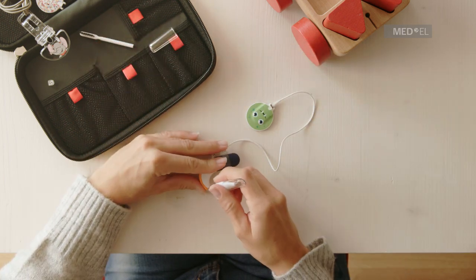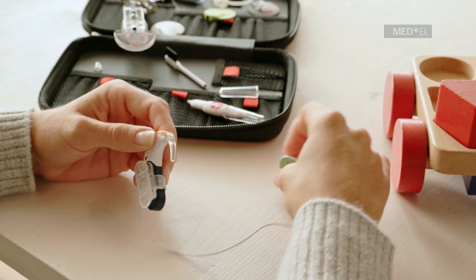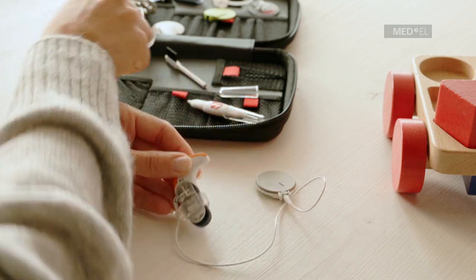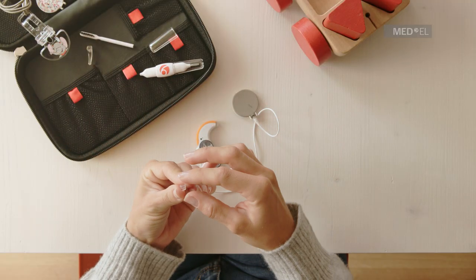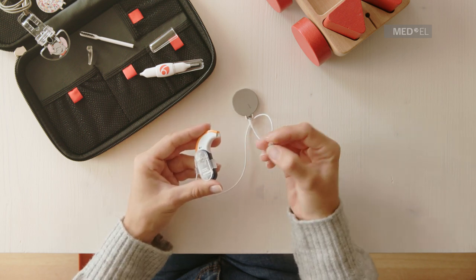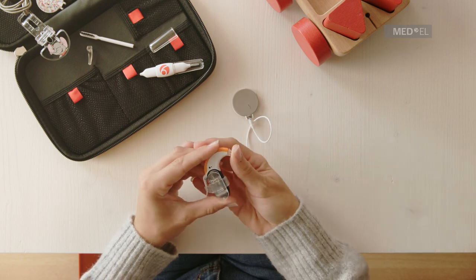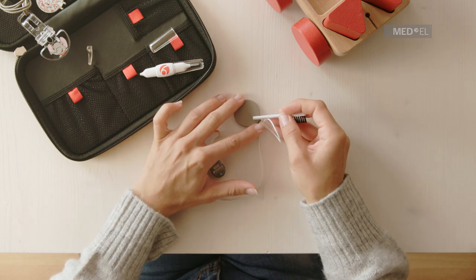Remove the earhook with the pin removal tool and replace it with the earhook cover by gently pressing it upwards. To insert the pin, you can use the magnetic end of the brush.